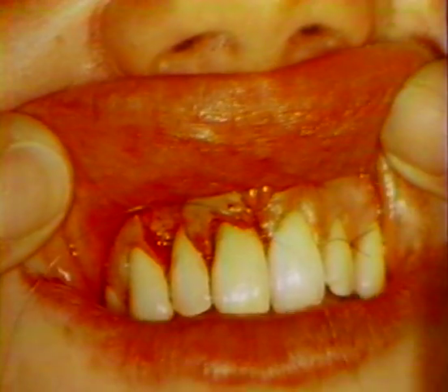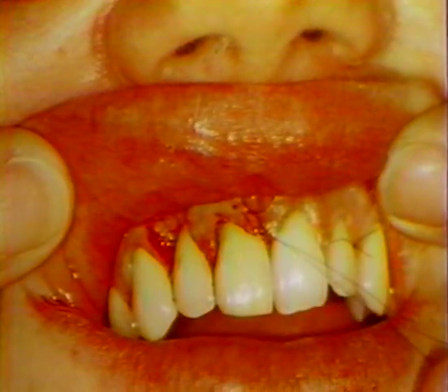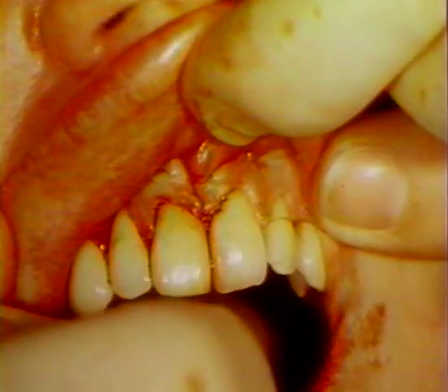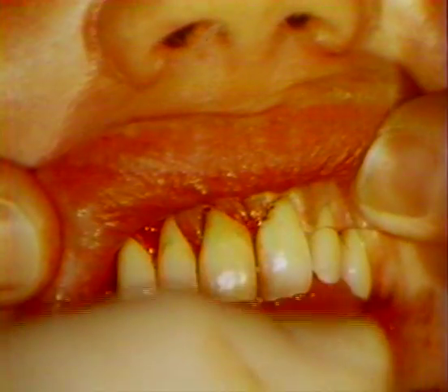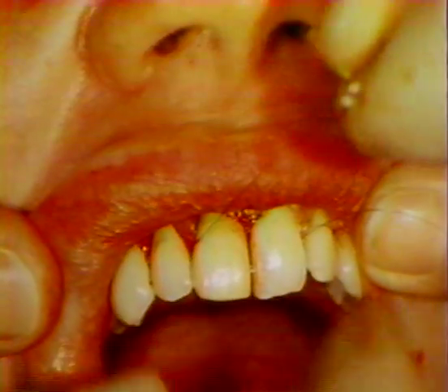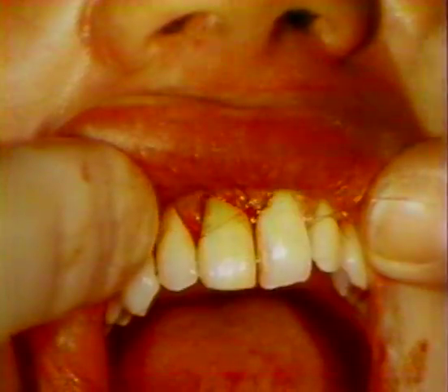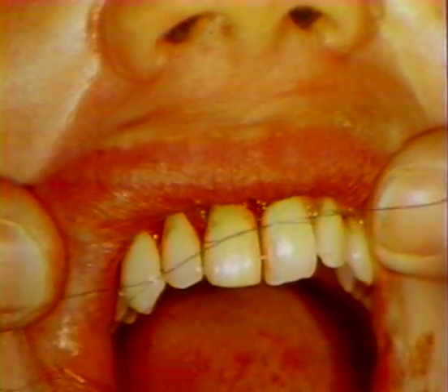Another suture is placed through the mesial incisal corner of the flap to improve its adaptation to the adjacent tissues. Both ends of this suture are carried through the contact of the central incisors to the palatal side. One end is then drawn through the left central lateral incisor contact back to the labial side, and the other end of the suture through the right central lateral contact. Their ends are drawn together and tied so that there is a slight pull on the flap.